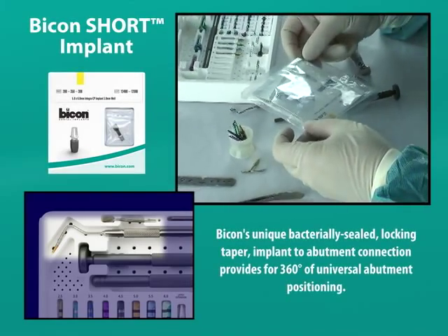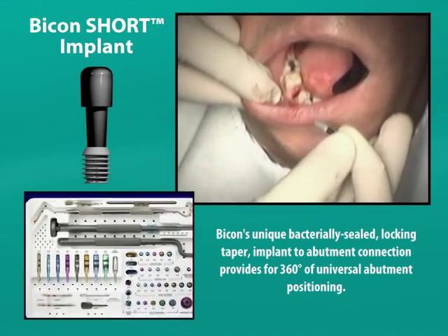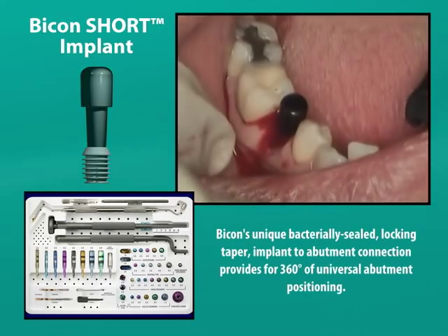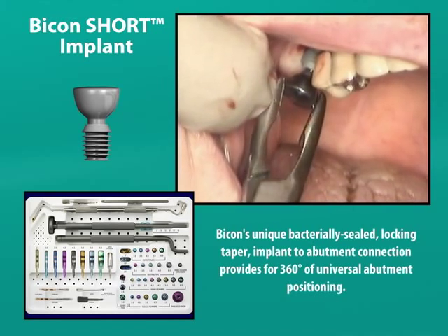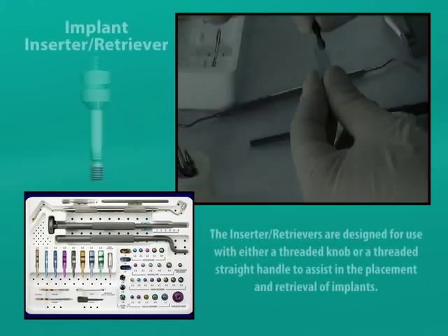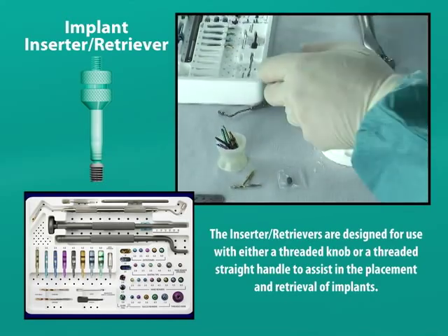While grasping the implant in its sterile packaging, we have three options for transferring it to the surgical site. First, we could transport and insert the implant into its osteotomy by grasping its black healing plug. Second, we could remove the healing plug and seat an abutment such as the sinus lift abutment into the well of the implant, which could then be transferred into the osteotomy site. And third, we could utilize an inserter retriever instrument or a seating tip to position the implant into its osteotomy.